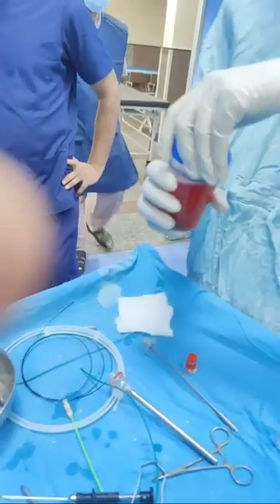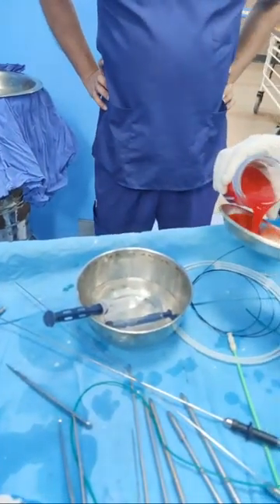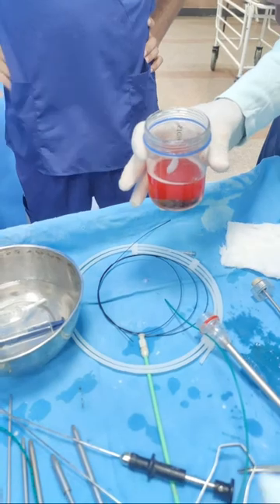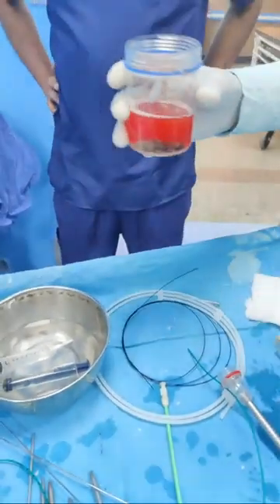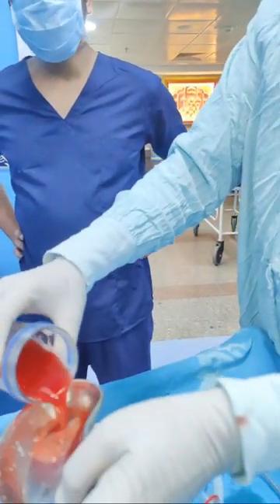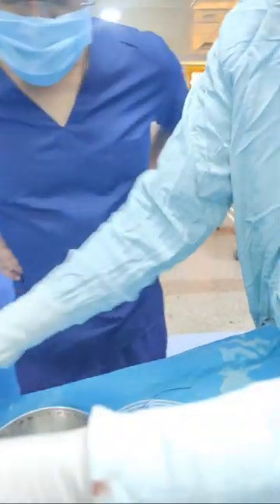Now show the stone fragments. Put the suction in. Sorry, it fell. Keep this, sister. Where is the kidney tray? Sir, I'll take out the blood part. What is this? Can you throw it? Saline. Pour the water so we can see all the fragments. No, we'll show it better then. Gauze piece, we can give a gauze piece. No, I'll show you. Check out this.